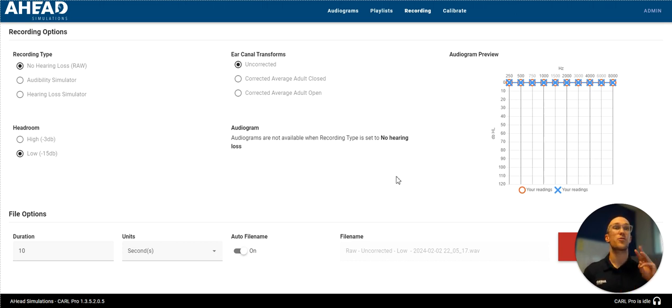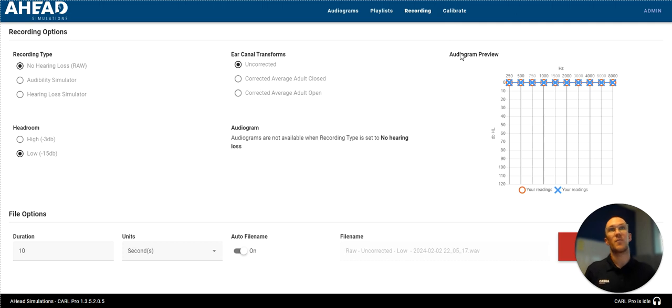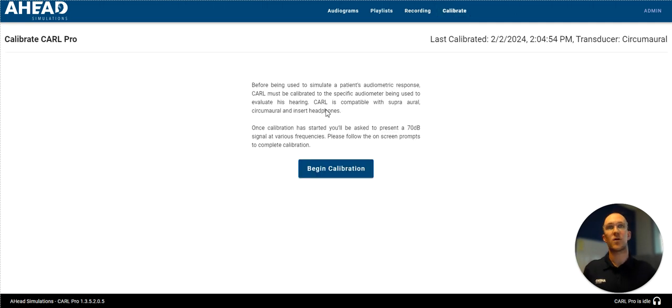Now number three, now we're going to look at calibrating Carl. So we want to do a hearing test. That's a big functionality. We might even want to get a little crazy and do some masking. So we're going to go over to calibration.